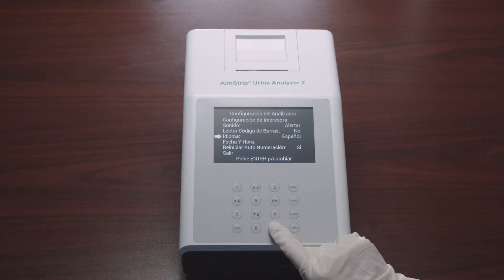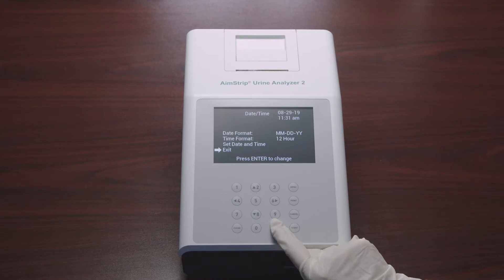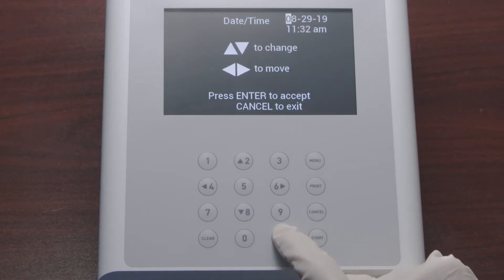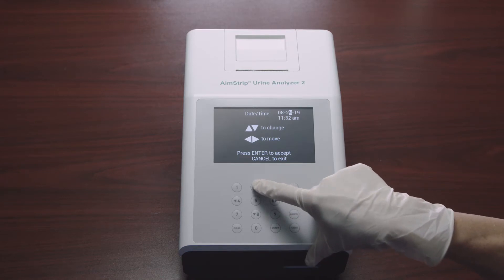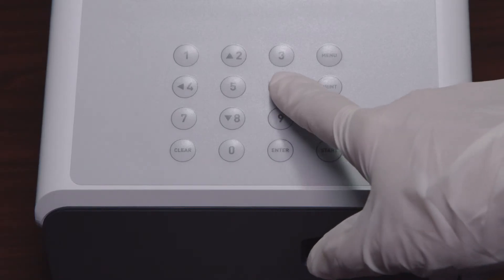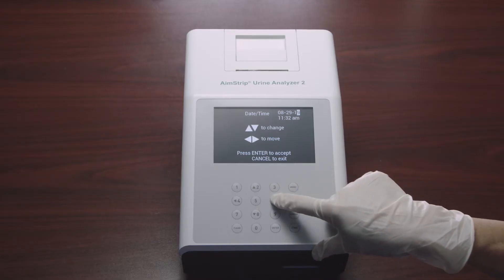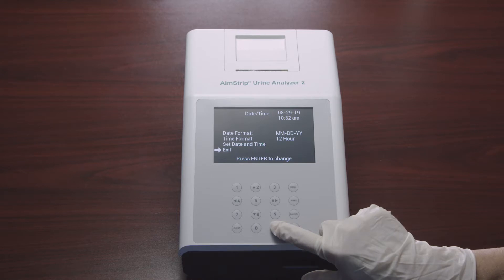The next selection is Language: select Language and press Enter to change it; each press of Enter cycles to the next language. Then set the current date and time by selecting Date/Time and pressing Enter, which allows you to set the date format, time format, and set date and time. Select Set Date and Time and press Enter — the first digit to be changed will be highlighted. Use the up or down arrows to change the number, then the left or right arrows to move to the next digit. Make sure to enter the correct date.